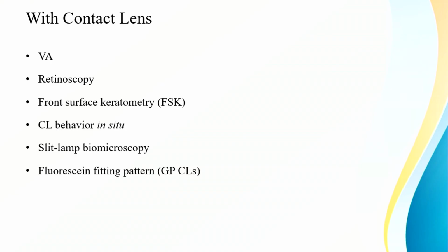So can I get to know how you assess a fit? The last class was a fit assessment. So the newcomer could explain to me the fit assessment of a soft contact lens. The CL behavior in situ for a soft contact lens will be centration, coverage, movement, and push-up. So push-up is positive or negative, how is the movement with blink, whether it's covering properly or not. This is a routine protocol which we follow.